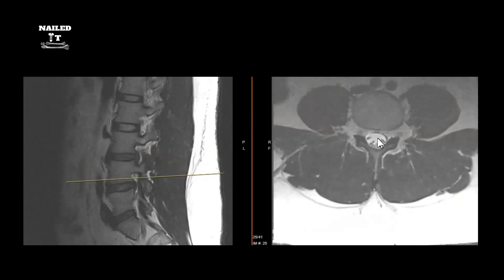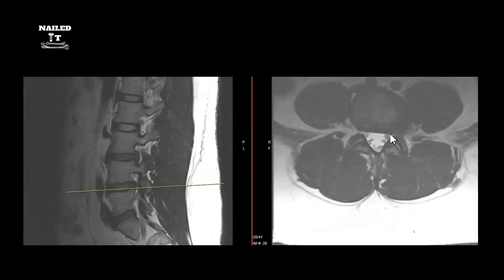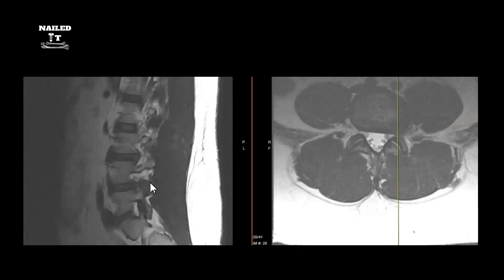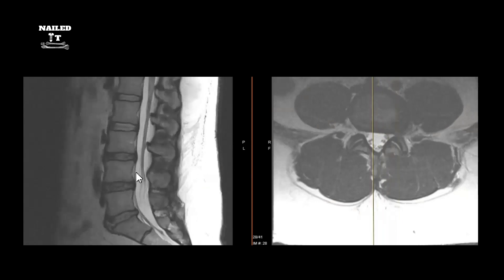Going down further, you can see he has another large, pyramidal far lateral disc bulge causing stenosis on that nerve root. Again, you have to see this patient clinically because he may or may not have symptoms. Looking at the actual foramen on the sagittal, there's still some fat around the nerve — but looking out here, he could possibly be symptomatic from that.